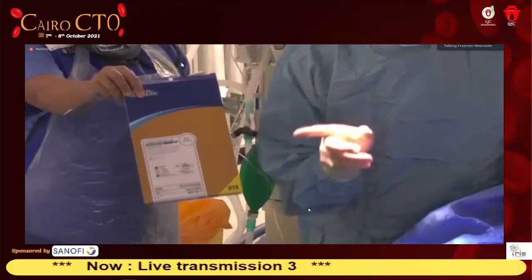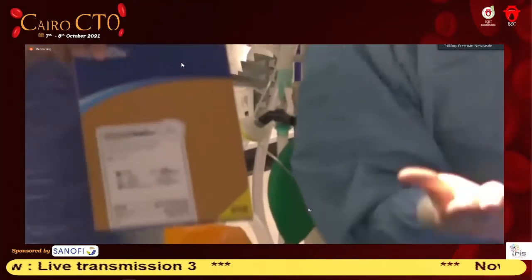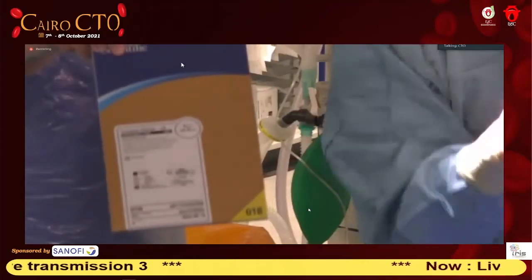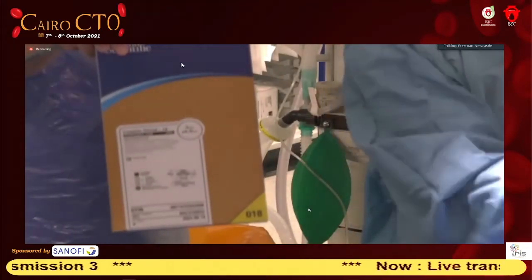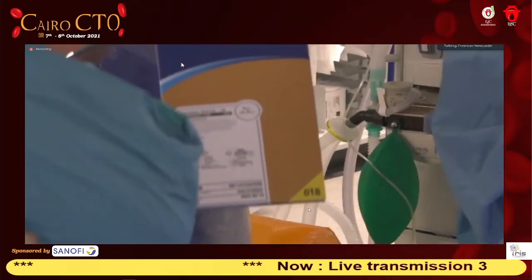Yeah. So when it comes out, it's usually a long wire, but when it comes out, it'll be... The wire is 018, huh? Yeah, but it becomes like a coil. You can see the shape of it. Yeah. That's how it constitutes in the artery.